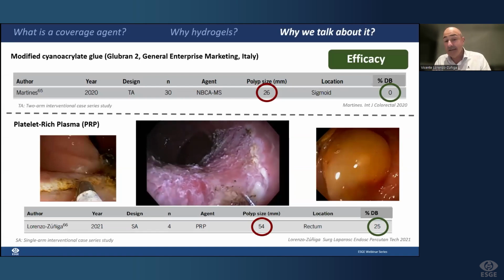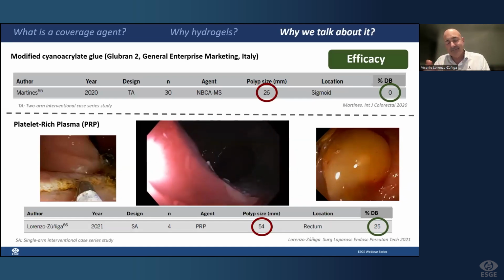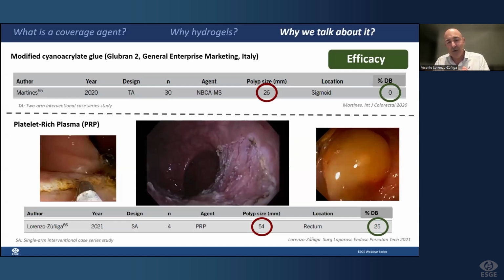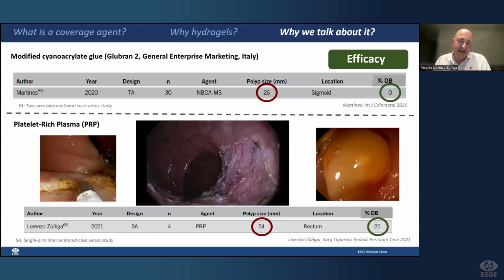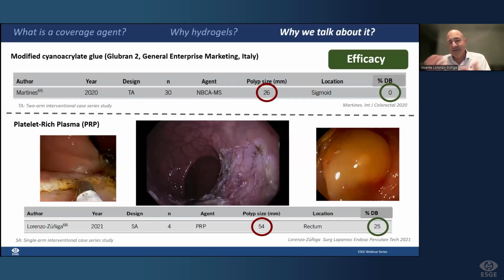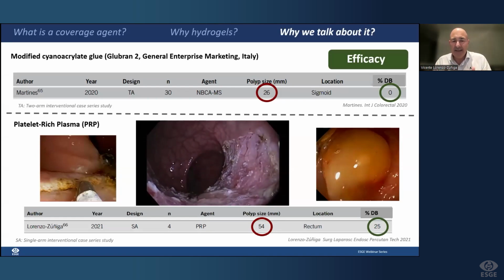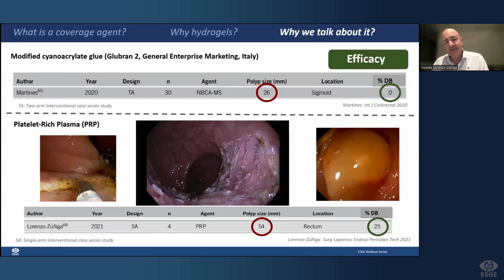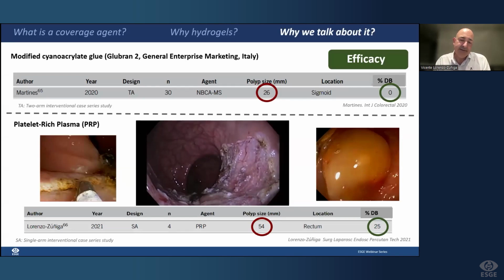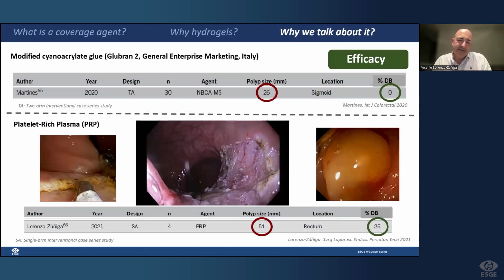The problem is that it is too liquid. The platelets need activation, through the alpha granules, when they come into contact with the collagen of the muscular layer of the submucosa, which activates the platelets and then starts the gelification. If you compare this video with the other, it makes sense that gelification is important, the density, to facilitate the coverage, because here gravity is an important unmet need. You can view in the inferior part how the gelification can start over the lesion, and then step by step, you can cover the total surface with platelet-rich plasma.